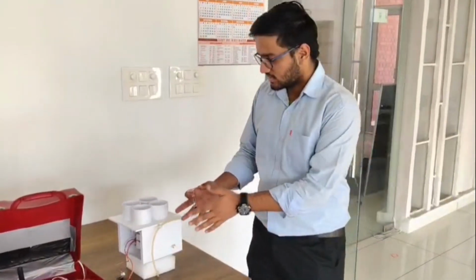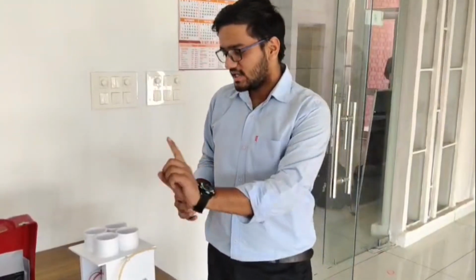The mathematical model for this works in such a way that basically at first we try to fill all the data: if we fill 0.5 ml, how much we are actually receiving, and at the gap of 0.25 we calculated all the data points and all the results that we are getting. After getting the results versus what we actually should get, we created a polynomial function using the AI so that we can calibrate and minimize the error to achieve the precision that we want. So after using the AI function, we achieved the precision that we wanted.